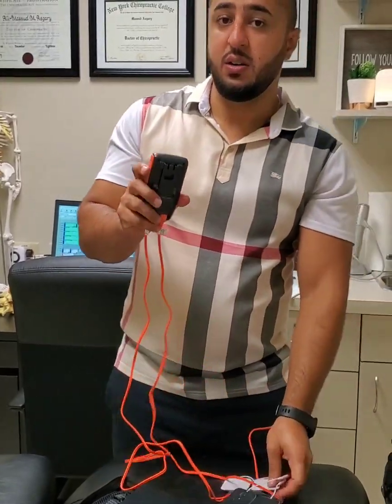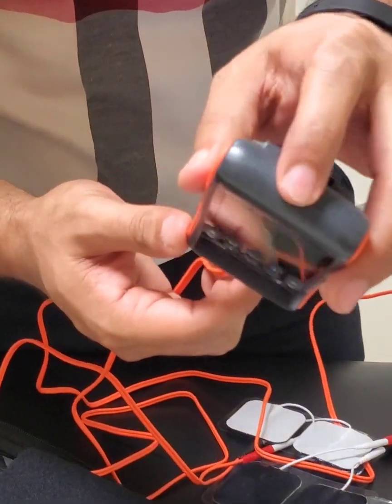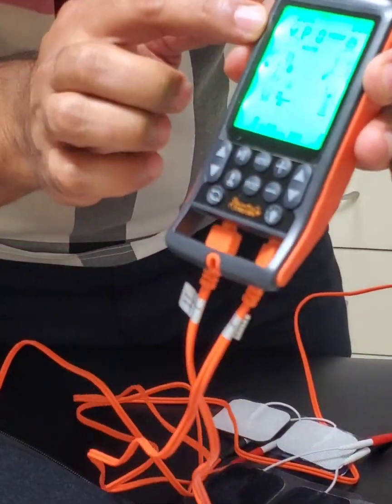Before you turn it on, you just have to hit the power button right here. Let me show you — you can zoom in right there. Hit the power button and it should turn on.